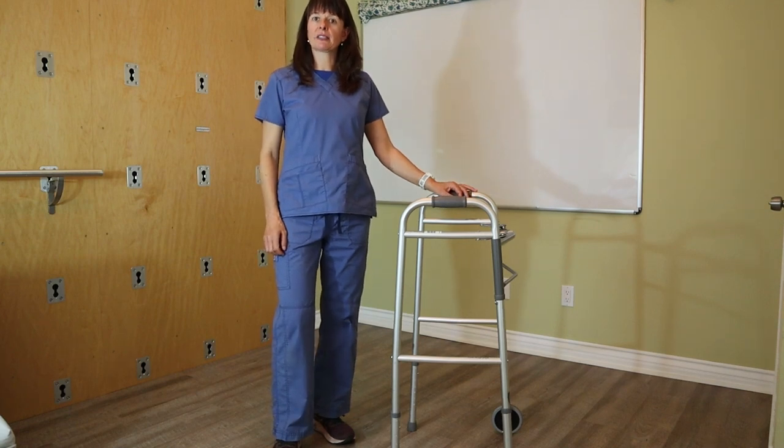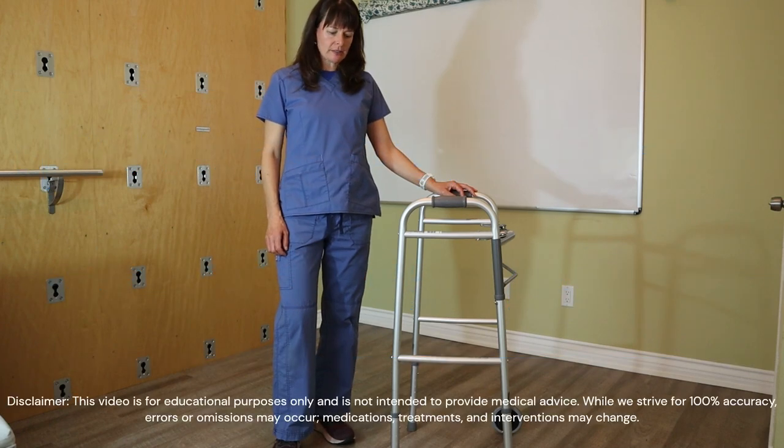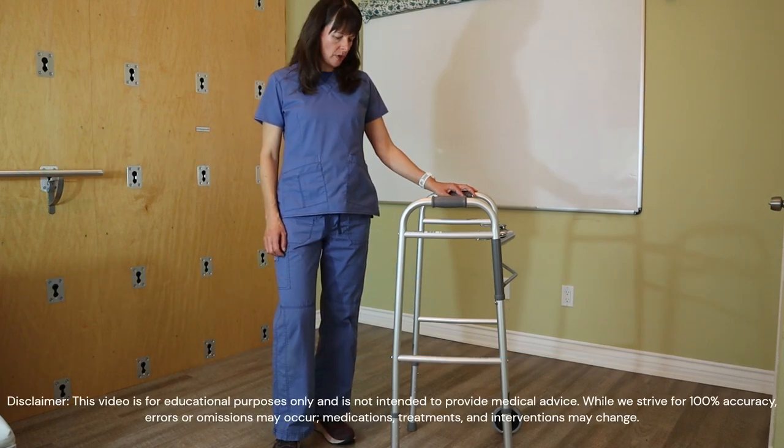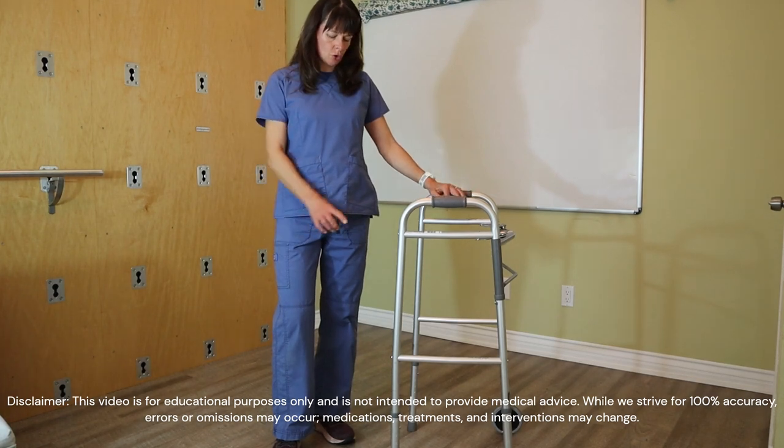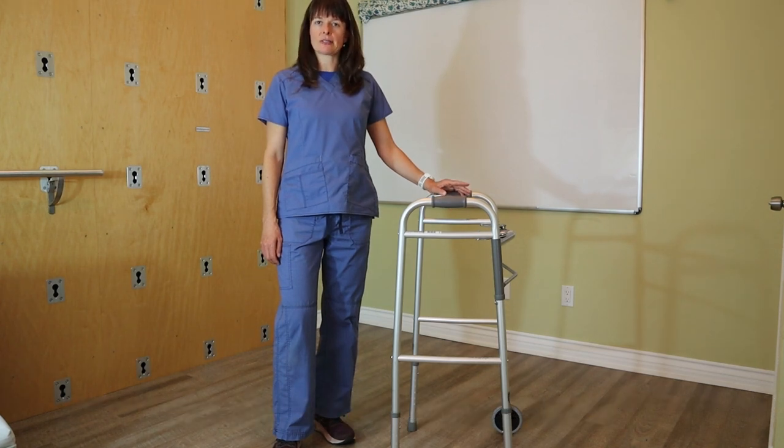Welcome to Nursing School Explained. In this video we cover how to properly adjust the height or sizing of a walker for a patient. This particular walker has two wheels in the front and two regular legs or pegs in the back. It doesn't really matter whether that's the case or not — the height adjustment is always the same.